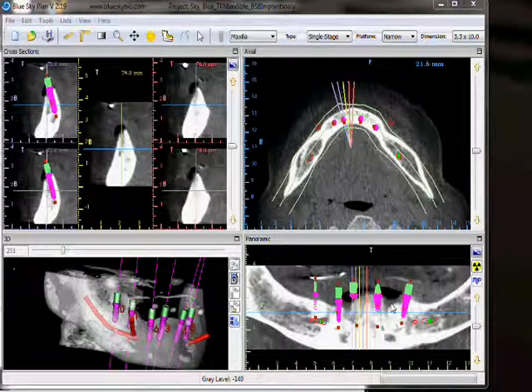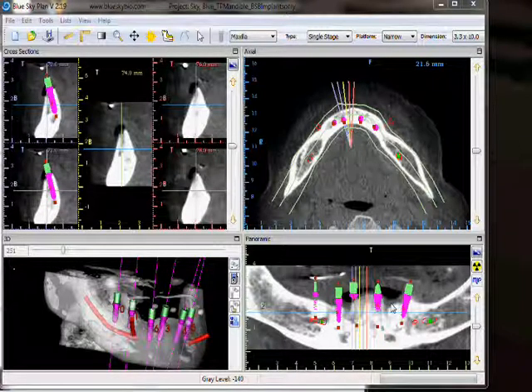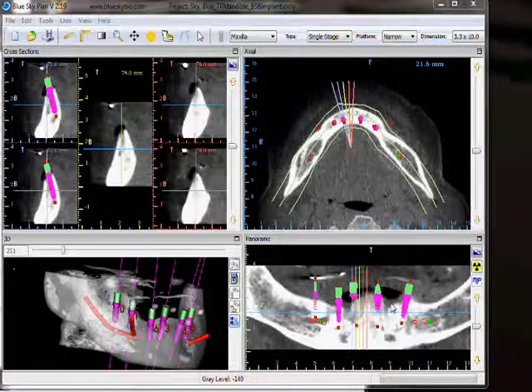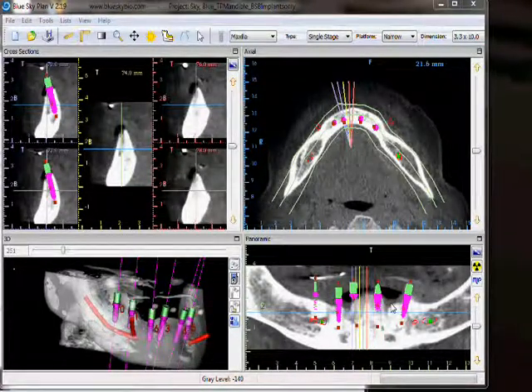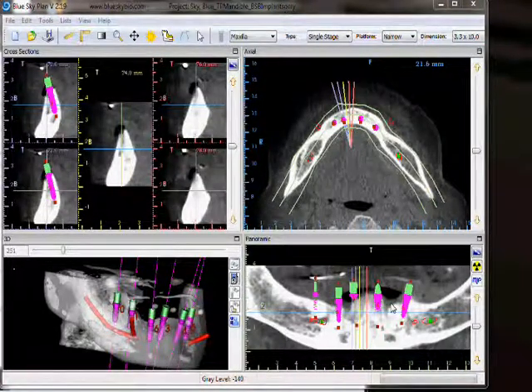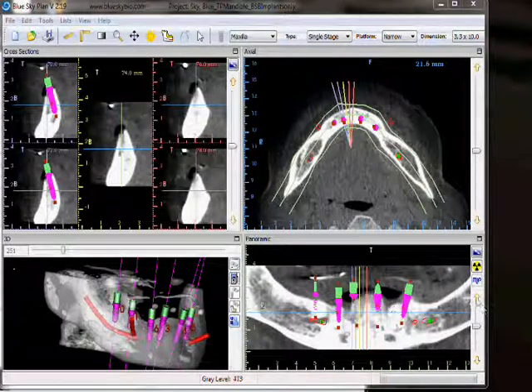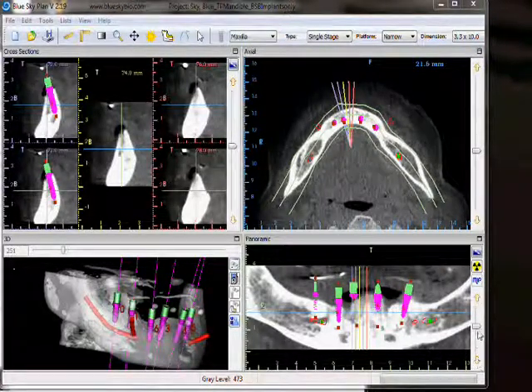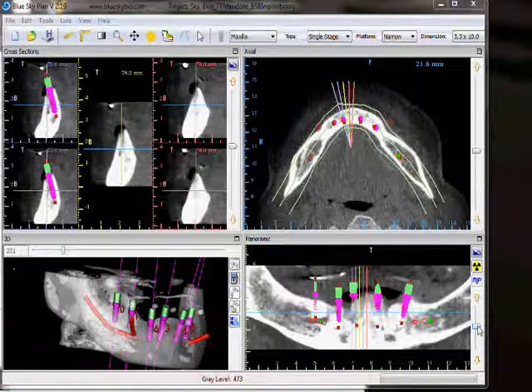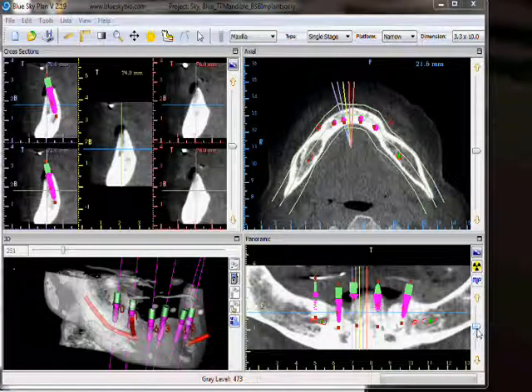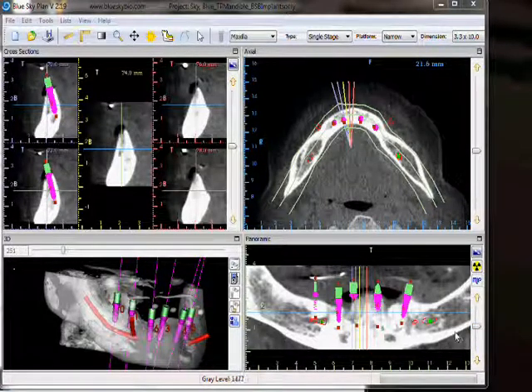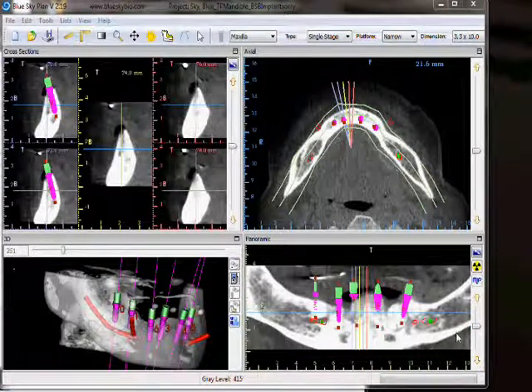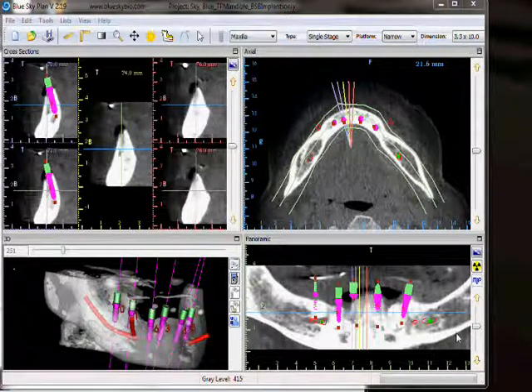The panoramic view displays vertical slices going buccal-lingual. We are able to flip through the slices by using the up-down arrows to the right of the view, or by grabbing the slider and moving it with our mouse, or by rotating the wheel on the mouse.